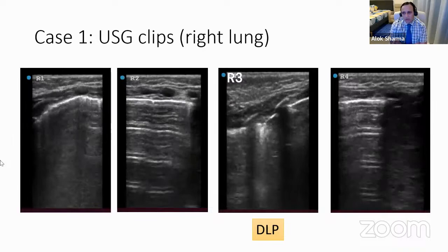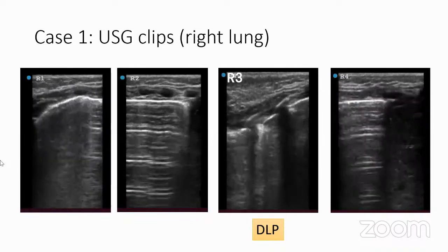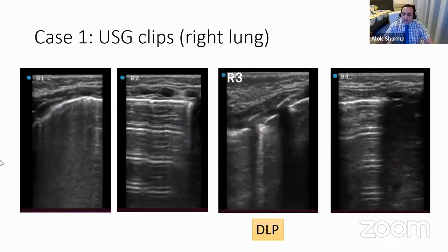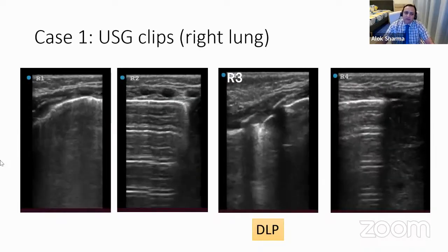What was the clinical course of the baby? So this baby was tapered off the respiratory support after 24 hours. So this was fitting clinically into TTN. Okay. So again, serial ultrasound really helps in such situations. You follow the clinical course, you do serial ultrasounds, and you'll get differential aeration.